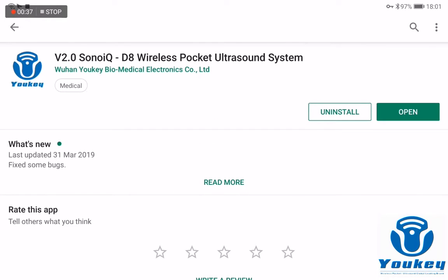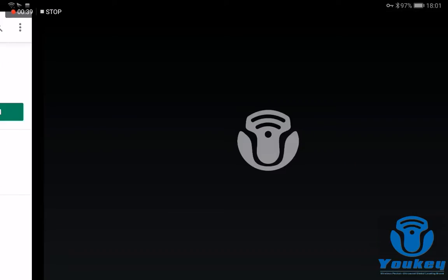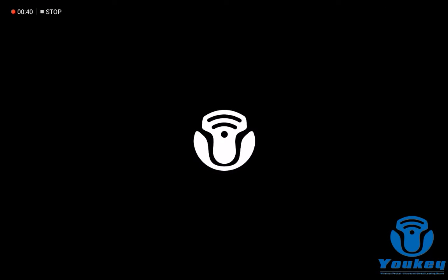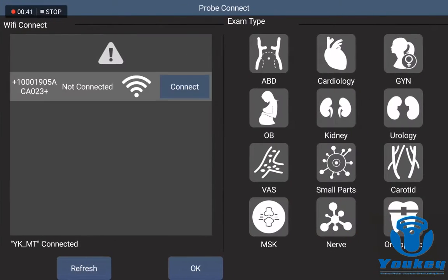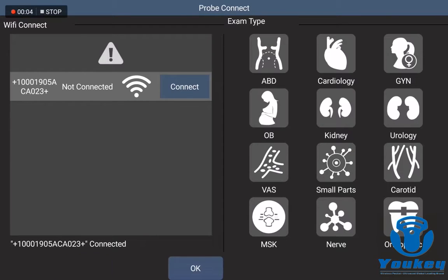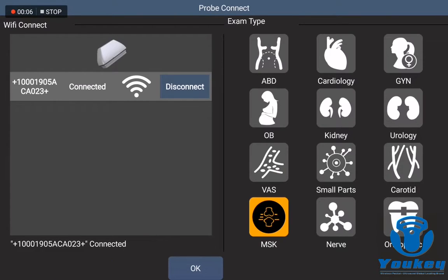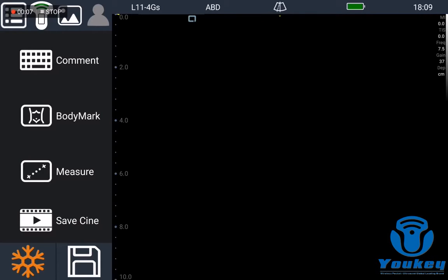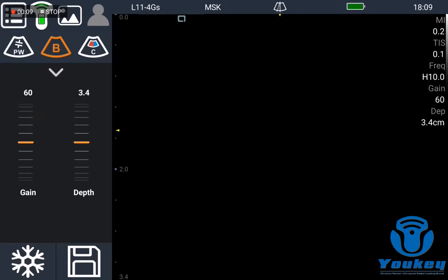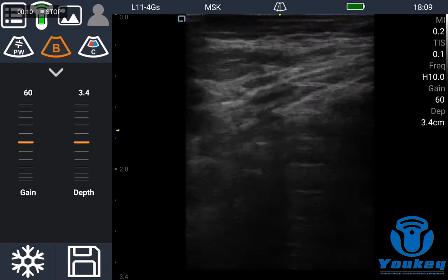Then you can install it and open it like this. You search for the Wi-Fi connection and connect it like this. It's very easy to connect and use.